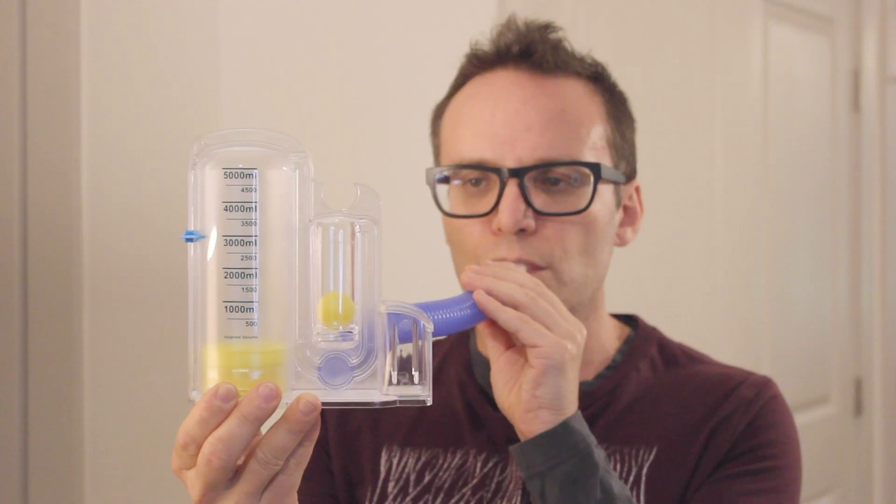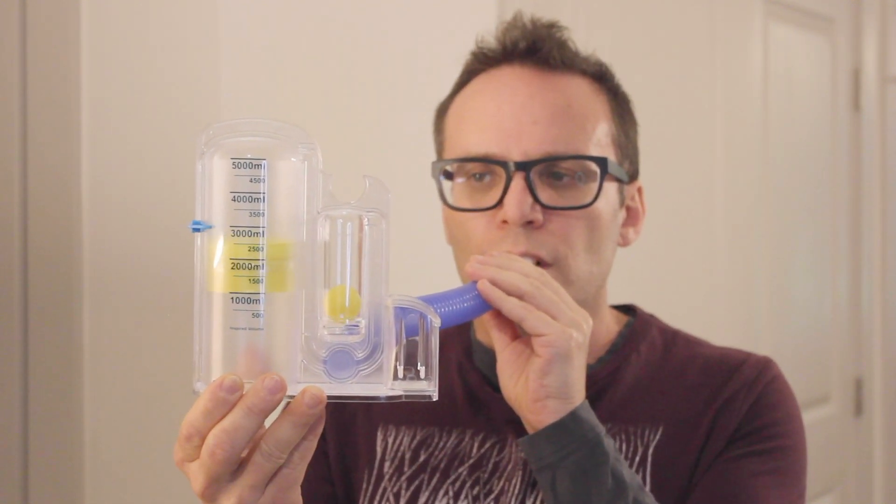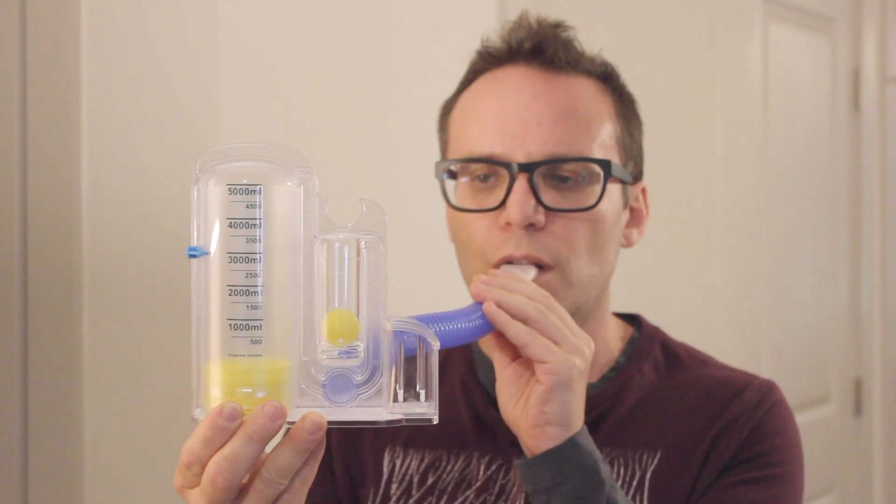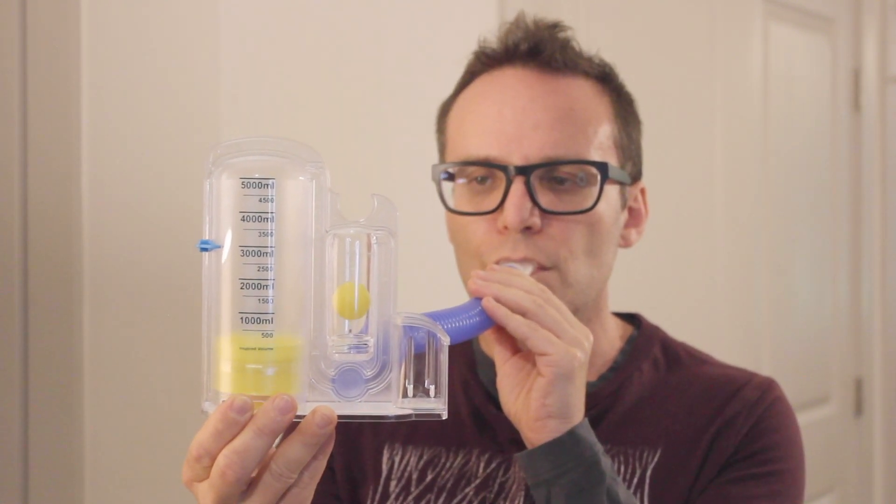Spirometers help us expand and exercise lung capacity following surgery, anesthesia, or injury. With regular use in the hospital or at home, you can help prevent complications such as pneumonia and maintain optimal lung health.